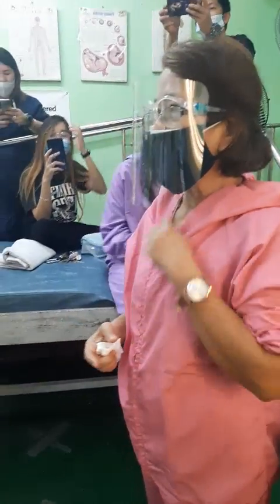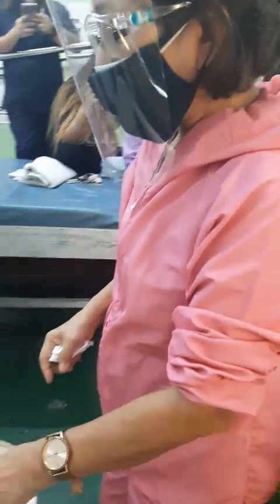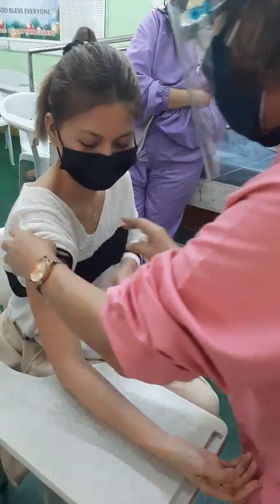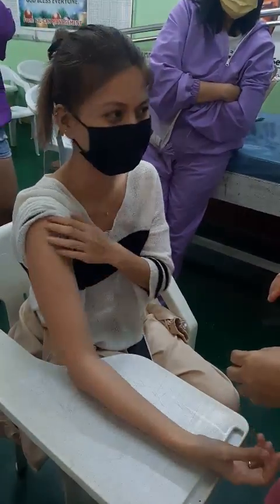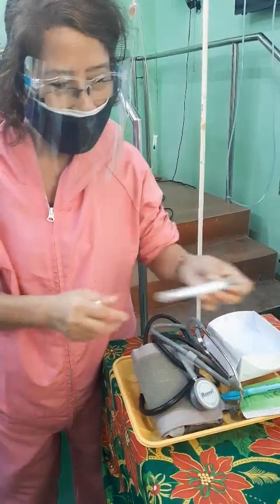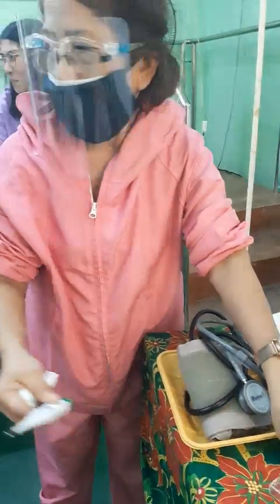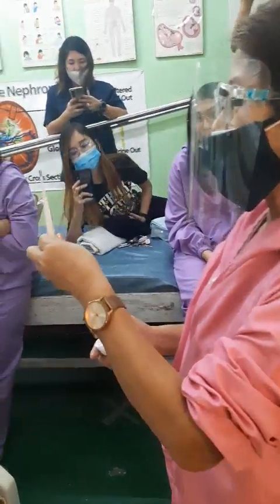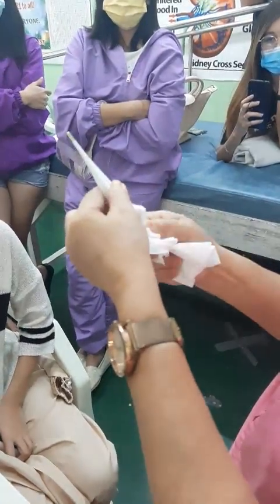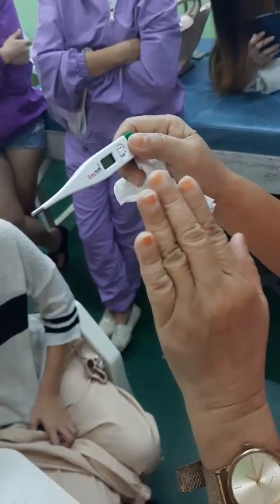Granting now that 5 minutes is over, I will now take your vital signs. First, I will see to it that the thermometer is clean and unused. I will wipe from the bulb — this is the cleanest — to the dirtiest. I will see to it that this is marked zero, starting from zero.